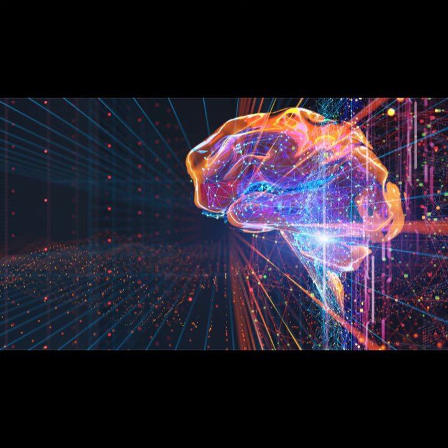Finally, MRI systems use different strategies, different paths to chart out K-space and collect the data you've got. Your standard grids, radial patterns, even fast spirals. But here's the thing. Whatever path you choose, it has to be done fast. Why? Because the signal you're measuring in K-space is really transient. It literally just flashes into existence after excitation and then decays pretty quickly.